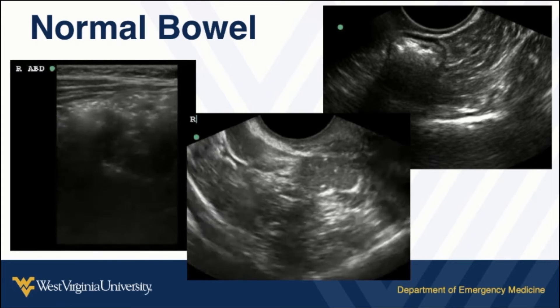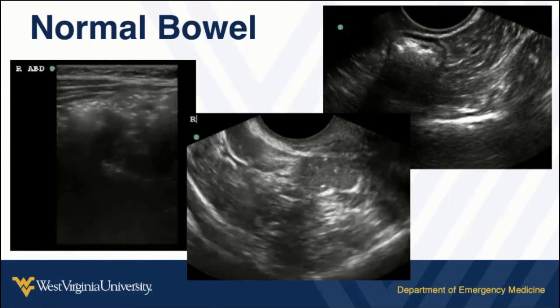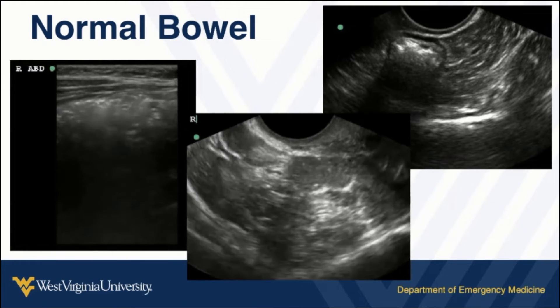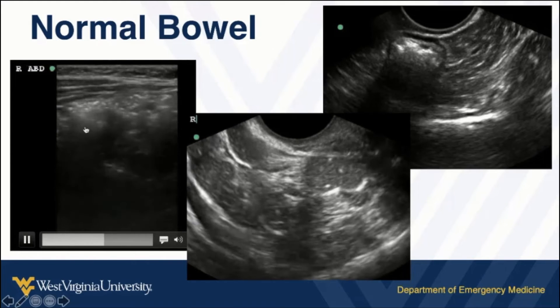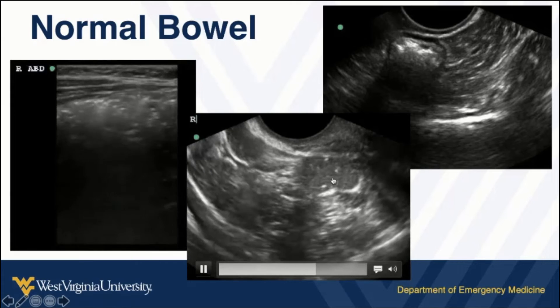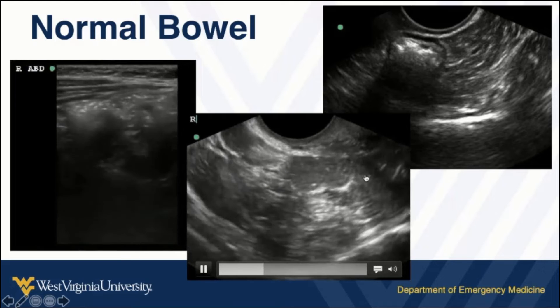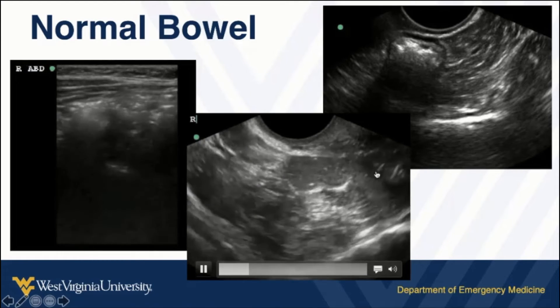There are some pathologies we'll look for in the bowel, although I'm going to save that for a different episode. For now we're going to look at what normal bowel looks like. A lot of times we'll just see this air signature. Sometimes we may see stool within the bowel — this gray area just looks like a black and white image of stool to me, outlined by the bright white wall of the bowel.